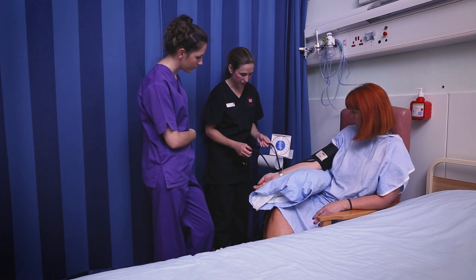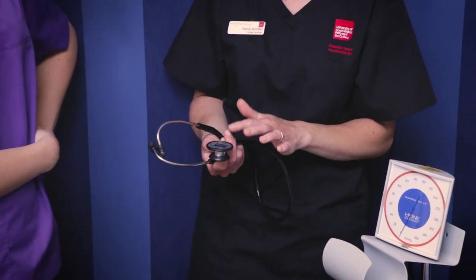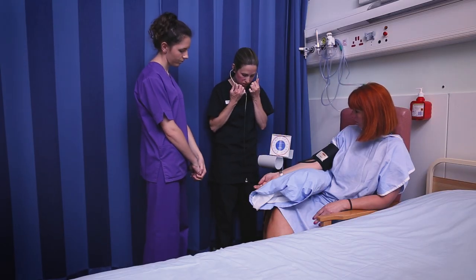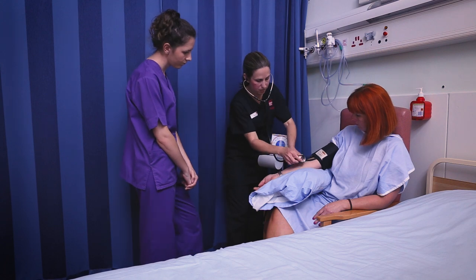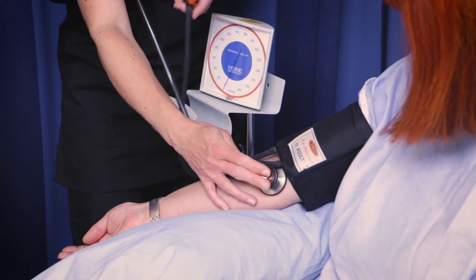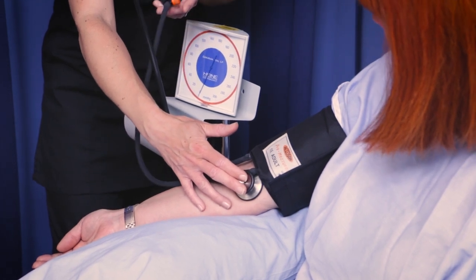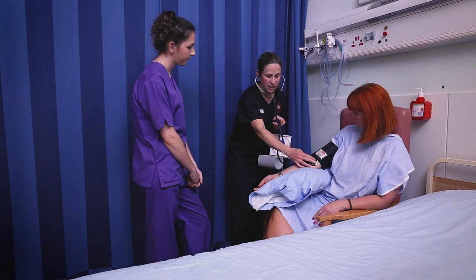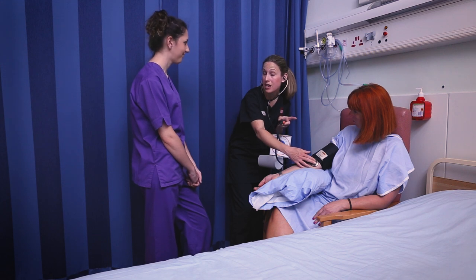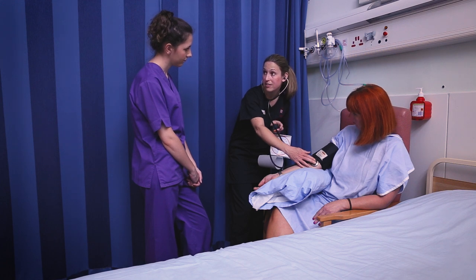Now for the next step, I need to get my stethoscope. We tend to use the diaphragm of the stethoscope for this. I'm going to place the diaphragm over the area of the brachial artery. This time when I pump it up, I'm going to pump it up to about 20 to 30 millimetres of mercury above the estimated systolic reading, and then let the cuff down very, very gradually. There are two sounds we listen for: the first tapping sound is the first Korotkoff sound, and that's the systolic reading. When the sound disappears, that's the fifth Korotkoff sound, and that's when we take the diastolic reading.